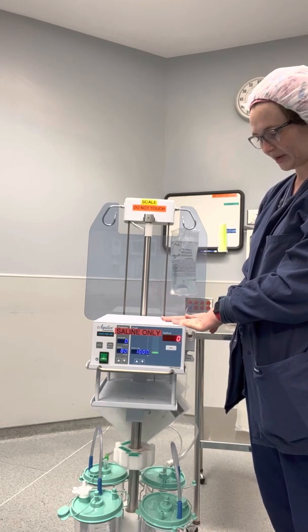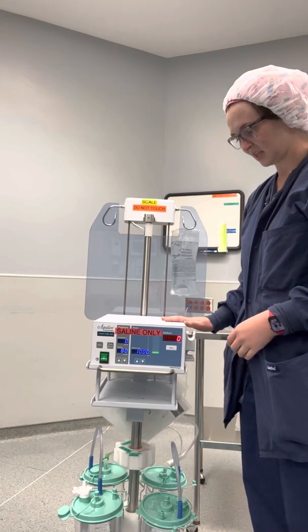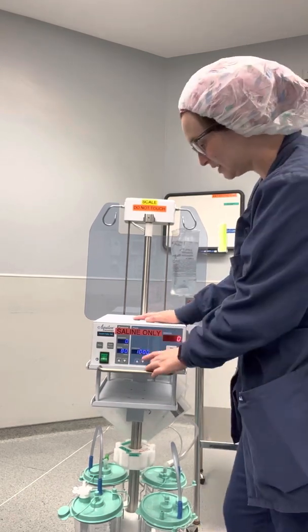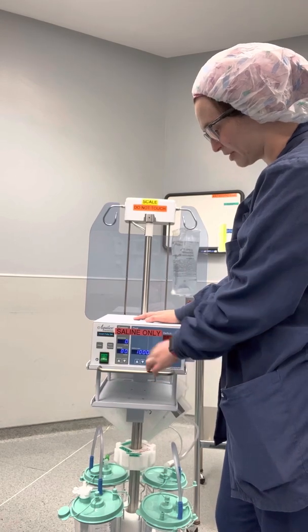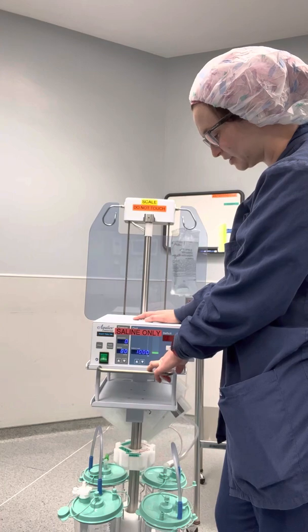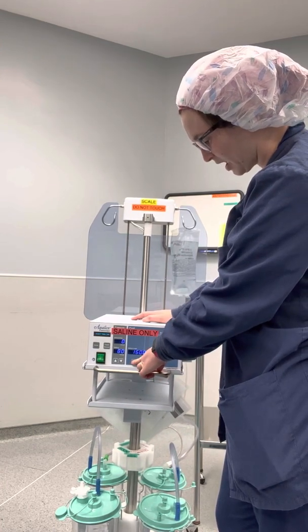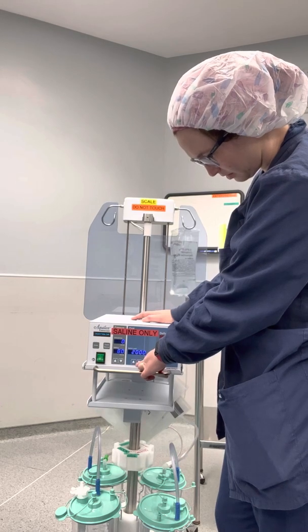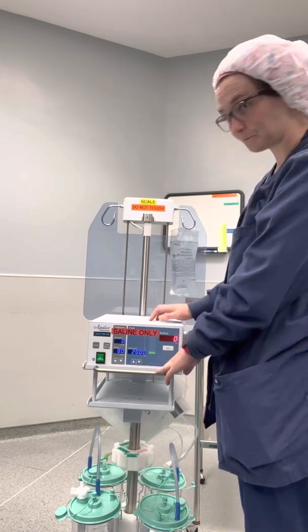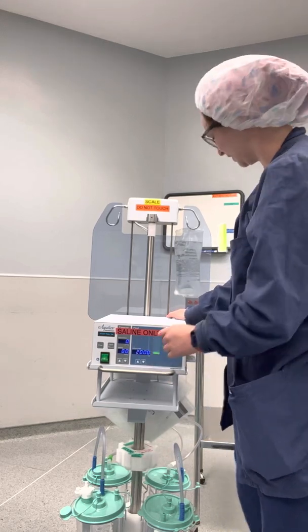The machine will go through its different processes to start up. From here, once you're operating, you can set your intrauterine pressure and you can set your deficit limit. We're going to set our deficit limit to 2,000.